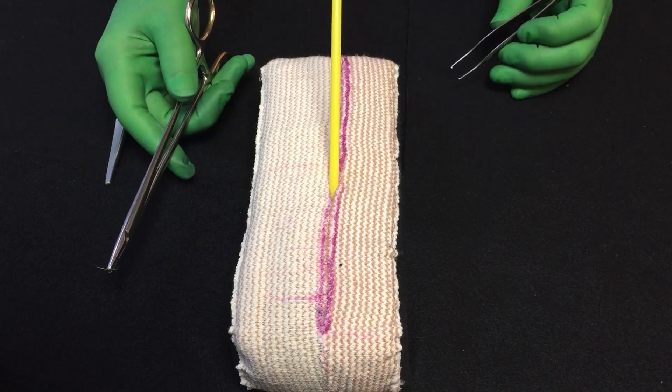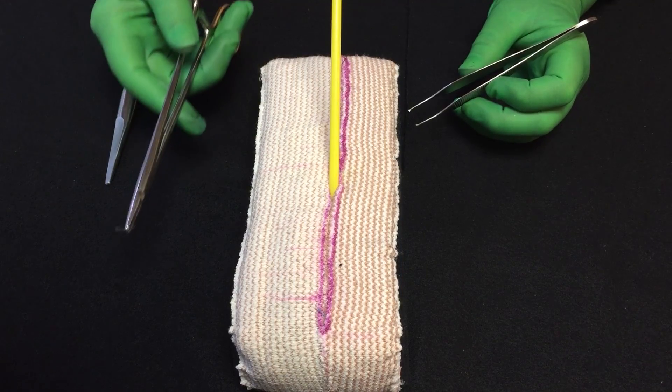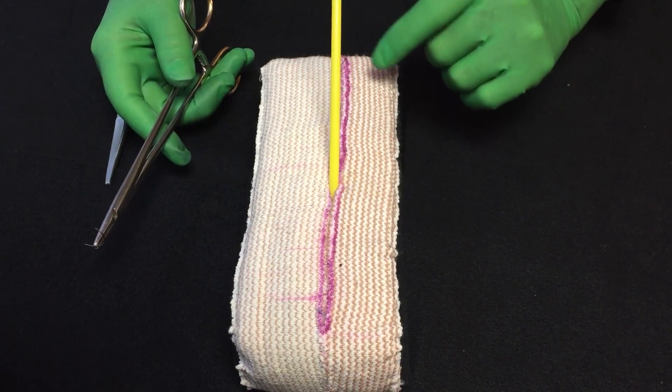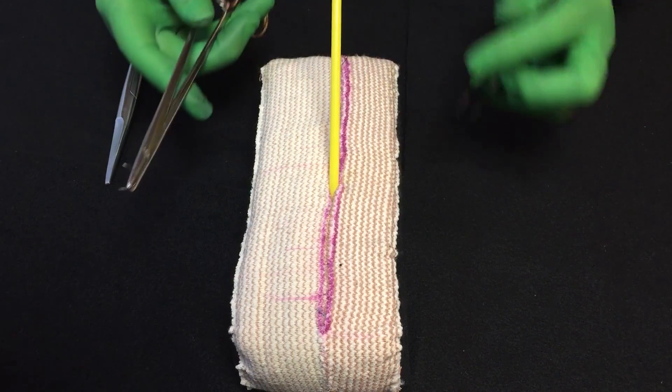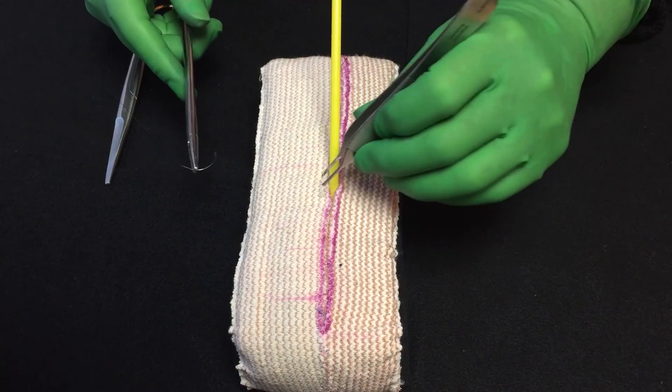I want to demonstrate how to put in a drain and tie it in so that it's easily accessible for the doctor to take it out in the office. So wherever you have your drain coming out, whether it's coming through the incision or whether it's coming out through a stab wound, if it's coming out through the incision, I try to go off the incision when I do this.